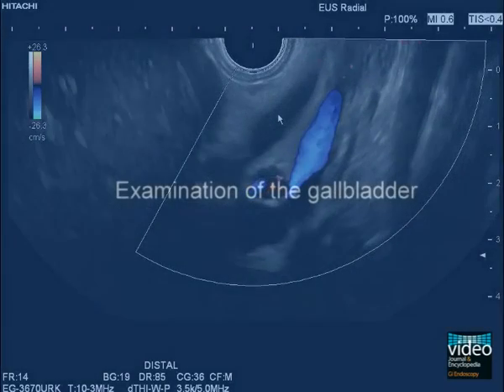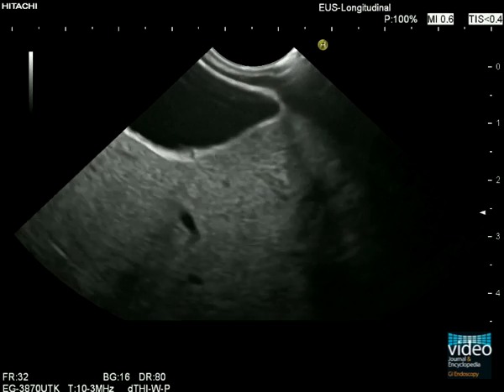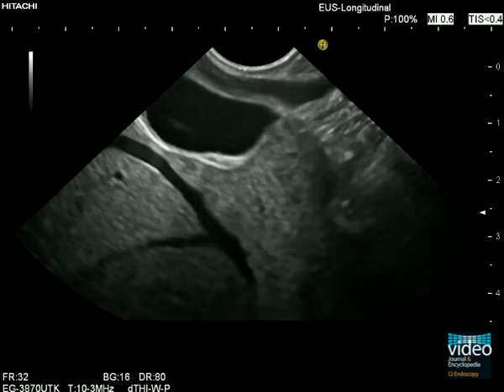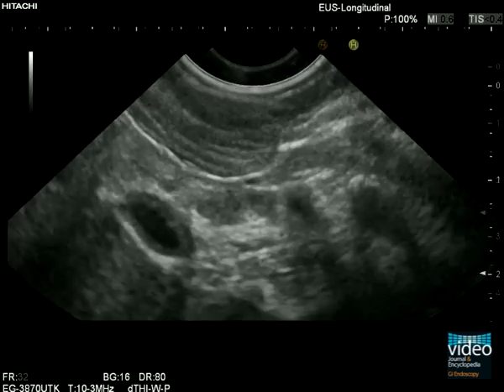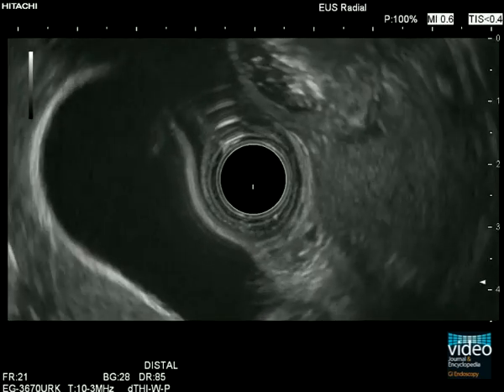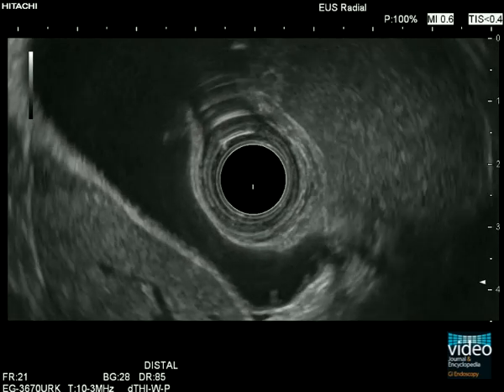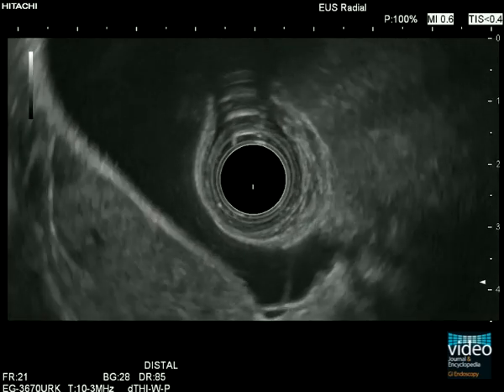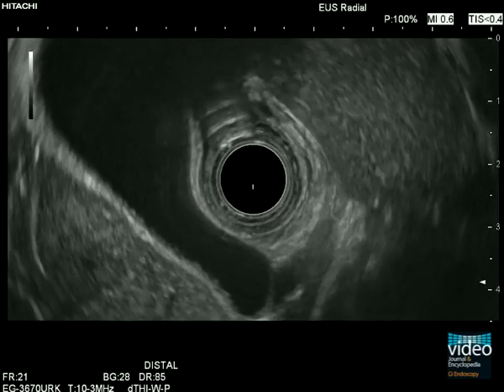The gallbladder is best examined using the radial scanning echoendoscope. However, when the longitudinal scope is positioned in the distal stomach, the gallbladder is usually visualized. Using the radial scanning echoendoscope, in almost all cases complete examination of the gallbladder can be achieved from positions in the duodenal bulb or in the distal stomach. The Heister valves are clearly delineated.